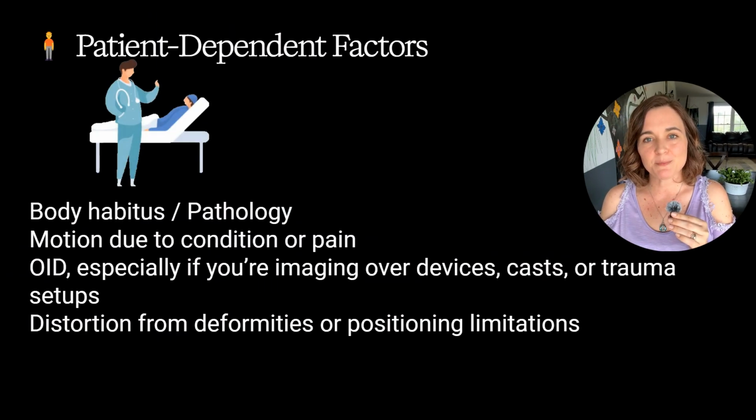Next up, patient-dependent factors, body habitus and pathology. Motion due to a condition or pain, OID, especially if you're imaging over devices, casts, or trauma setups, distortion from deformities or positioning limitations. These require adaptation. You may need to change technique, positioning, or expectations, but they're often out of your direct control.